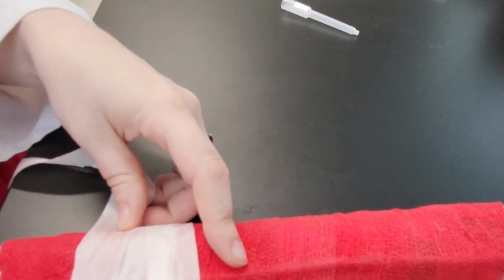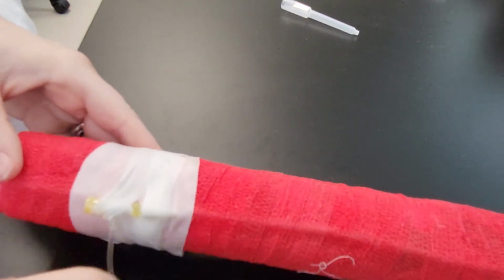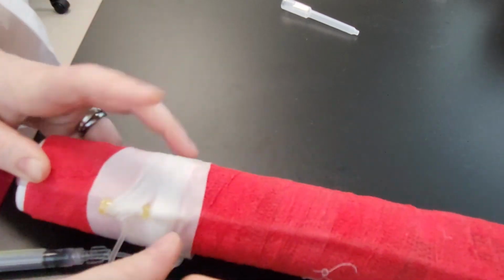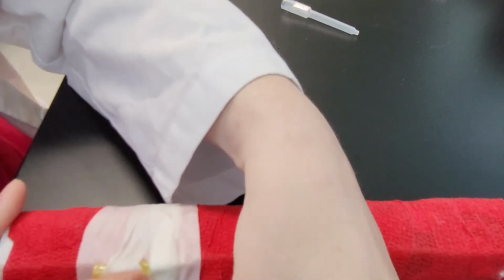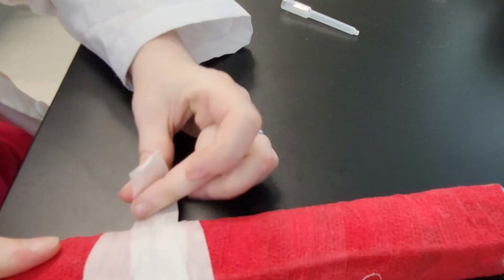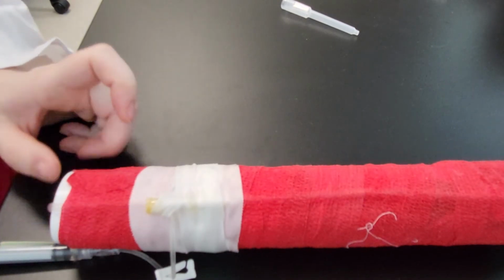We will be inserting many needles into this, and we want to make sure our patients do not get any infection from us. So we want to keep this as clean as possible. So we'll place that underneath the injection port and then wrap everything all around. And this piece of tape is where you can actually cover the full hub of the catheter. Like so.